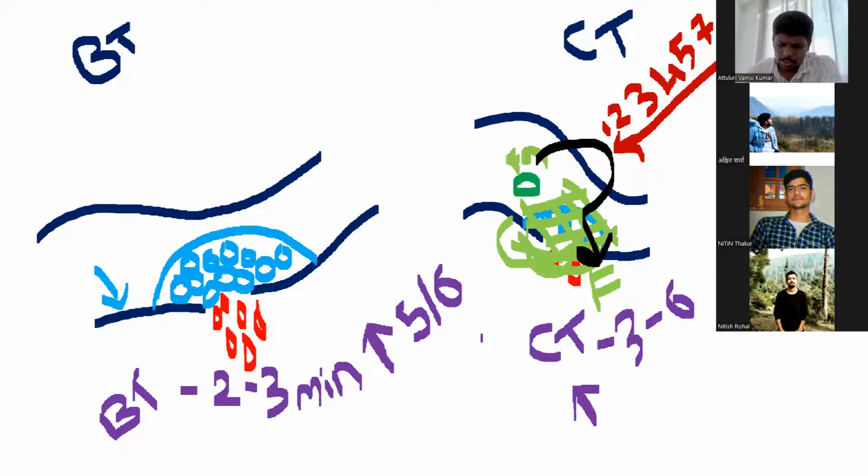Capillary tube. I will tell what a capillary tube is. A capillary tube is a very small, very narrow, very thin glass tube, thinner than your refill. I will prick the finger and collect the blood into the capillary tube. Because of surface tension, the blood will automatically draw into the tube, so the tube will be filled with blood.